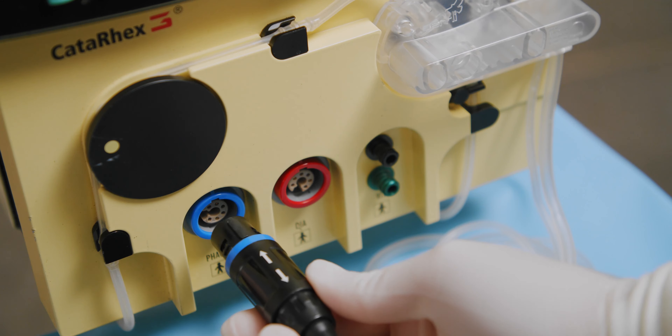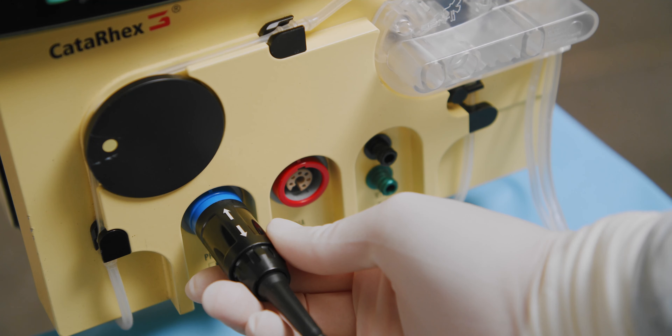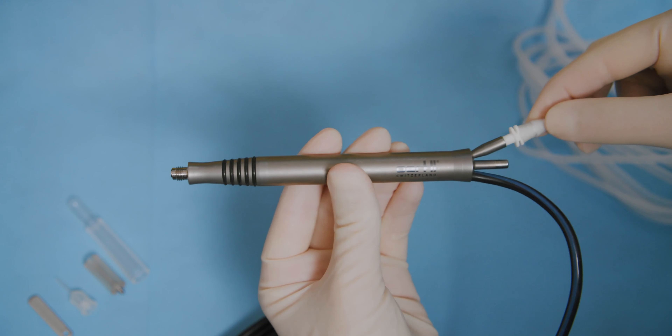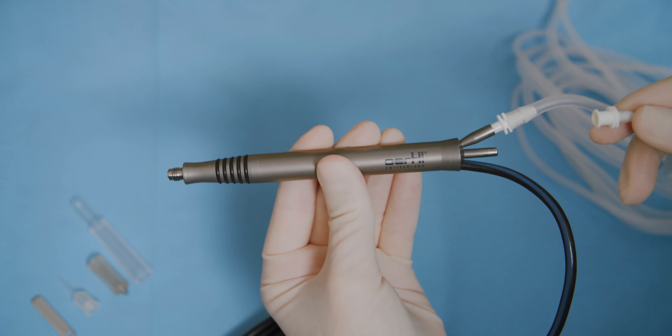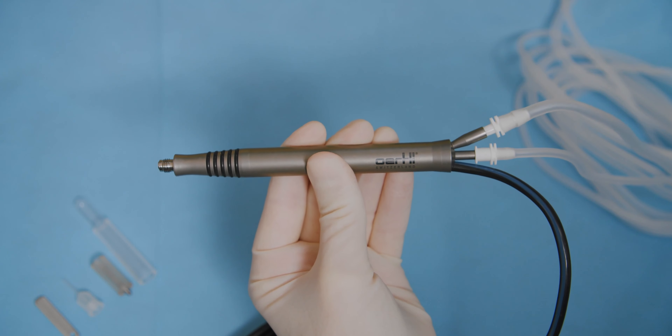Connect the FACO handpiece to the Cataracts device. The FACO handpiece has a blue ring that matches a blue ring on the machine. The arrows must be visible once connected. Connect the irrigation and aspiration lines to the ports on the FACO handpiece and make sure that the connections are secure.